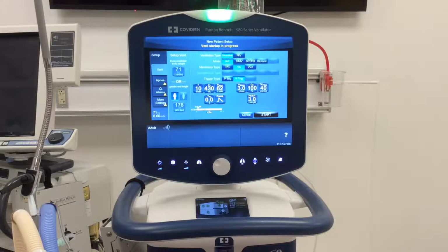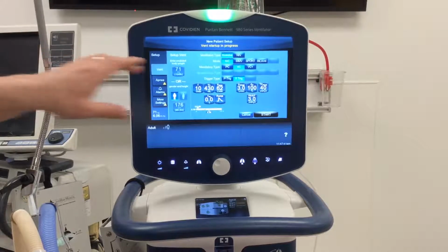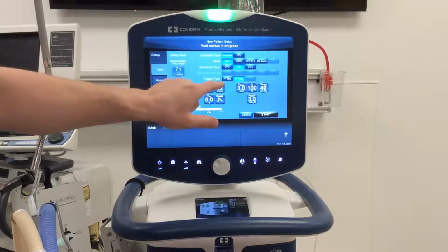It's volume targeted pressure control, so it goes up or down on pressure to get us where we need to go. It is quite basic, but once again, not really basic until we get into the tried and true, the volume control and pressure control here. Okay, so we're going to go ahead, I'm going to go with volume control.